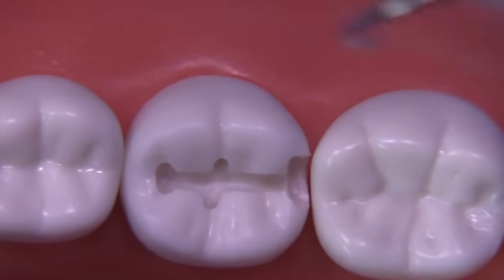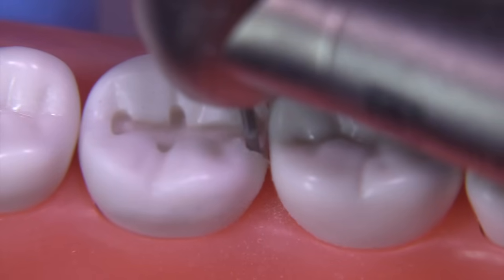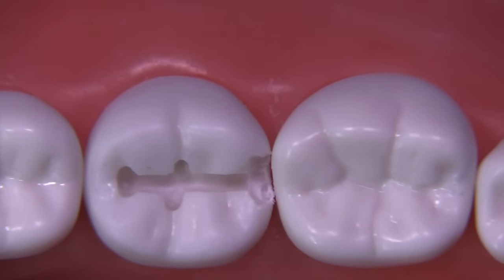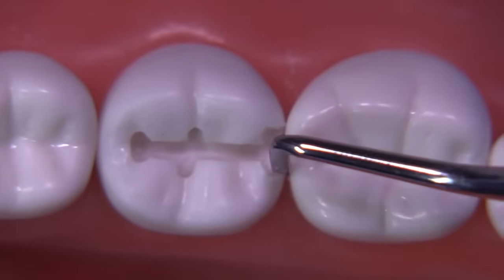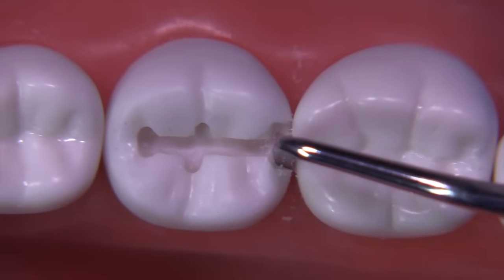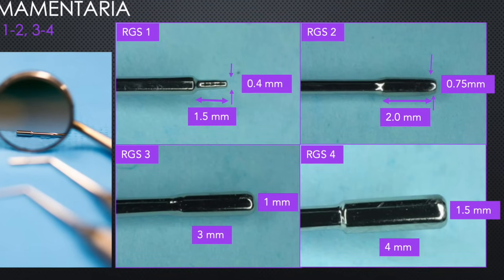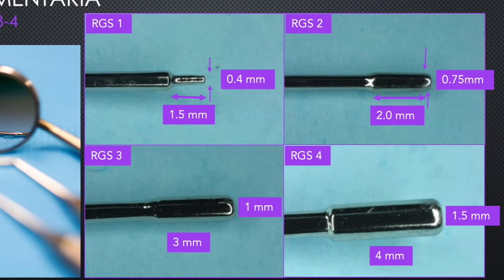We have some extensions to fix. Some areas are less extended than others, so we need to be very mindful of areas that are smaller and focus on under-extended areas to get them to the same amount of extension as areas with more clearance. This is the slow part of the class 2 — it takes effort and focus. Many of you are familiar with the RGS 1, 2, 3, and 4 instruments. They're used by thousands of students around the world and are great for determining extensions on many different preparations — I've mentioned these in several of my videos.